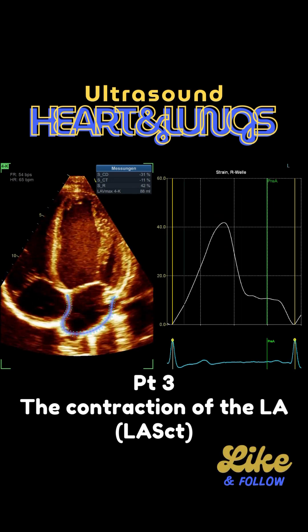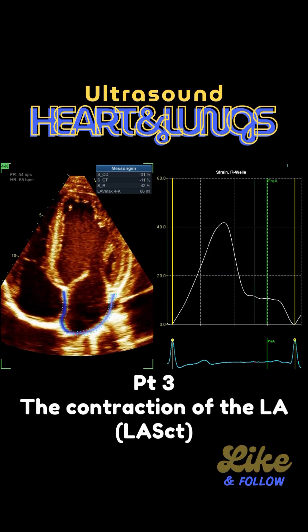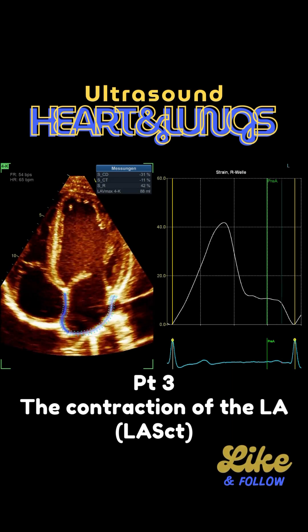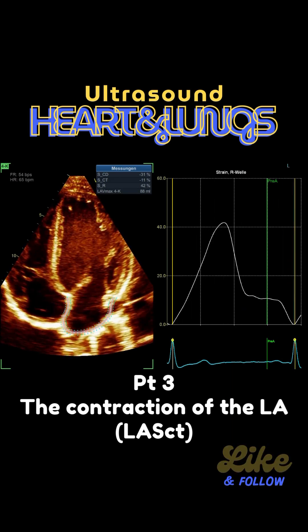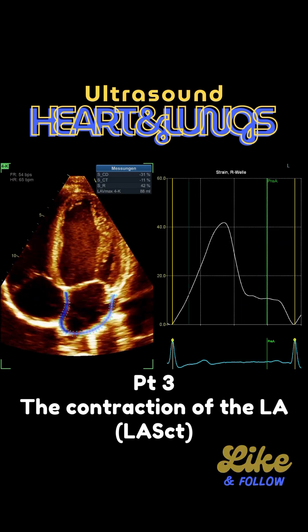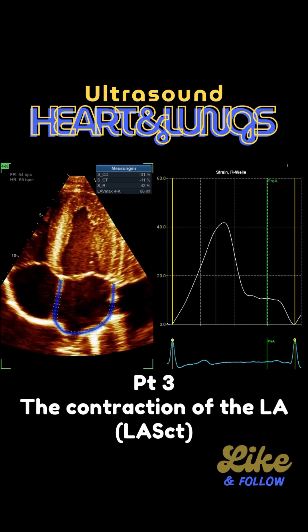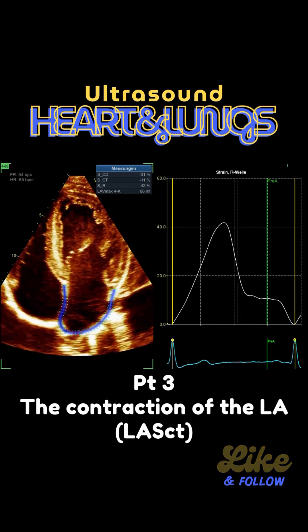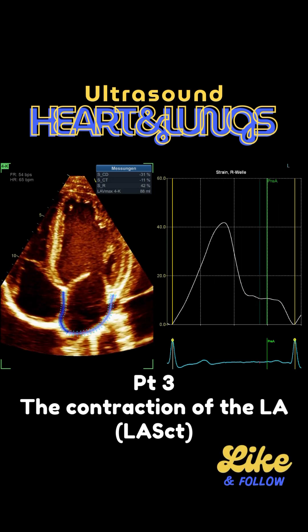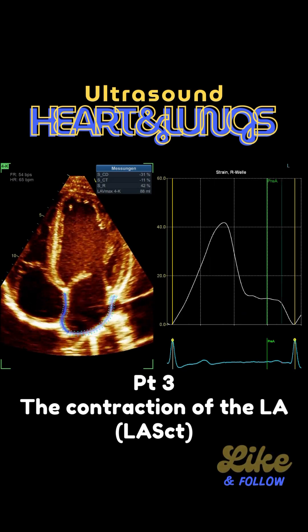Take a look at the strain curves now. You see the left atrial strain follows quite nicely the left atrial borders. The first measurement is about 40%, so this is the left atrial strain reservoir, then the conduit follows. Just before the P-wave — a little bit more to the right — the green line needs to be placed for an optimal measurement of left atrial strain in contraction. Overall, the measurements will be accurate: the reservoir phase is 42%, the conduit minus 31%, and the contraction minus 11%.